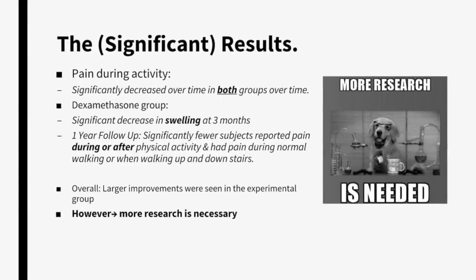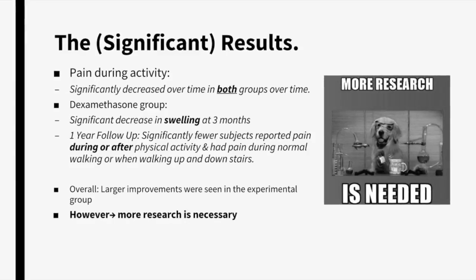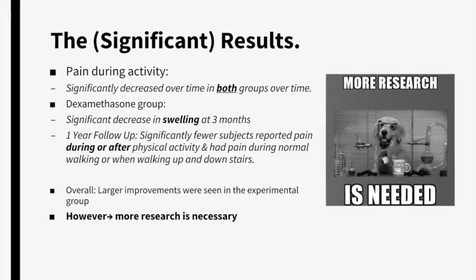There were several significant results determined utilizing a significance of p equals 0.05. The results show that pain during activity was significantly reduced in both groups over time. However, the experimental group experienced a significant decrease in swelling at 3 months.